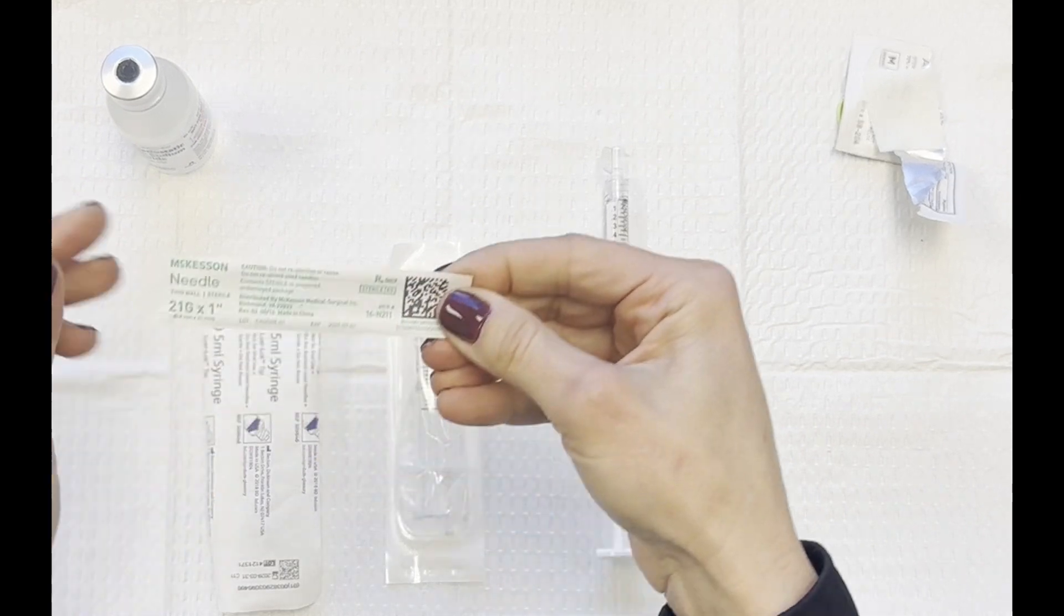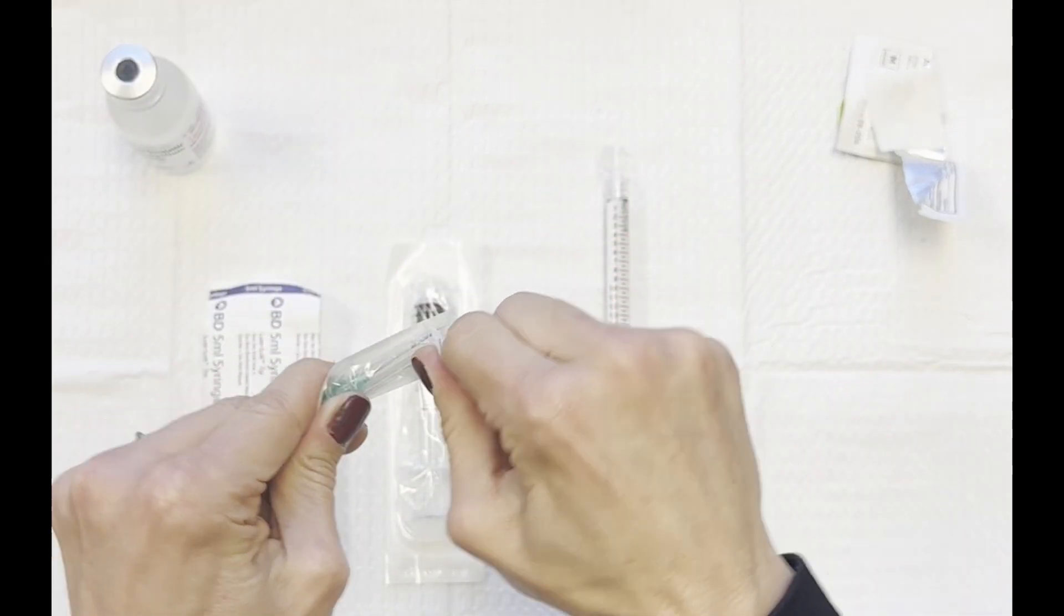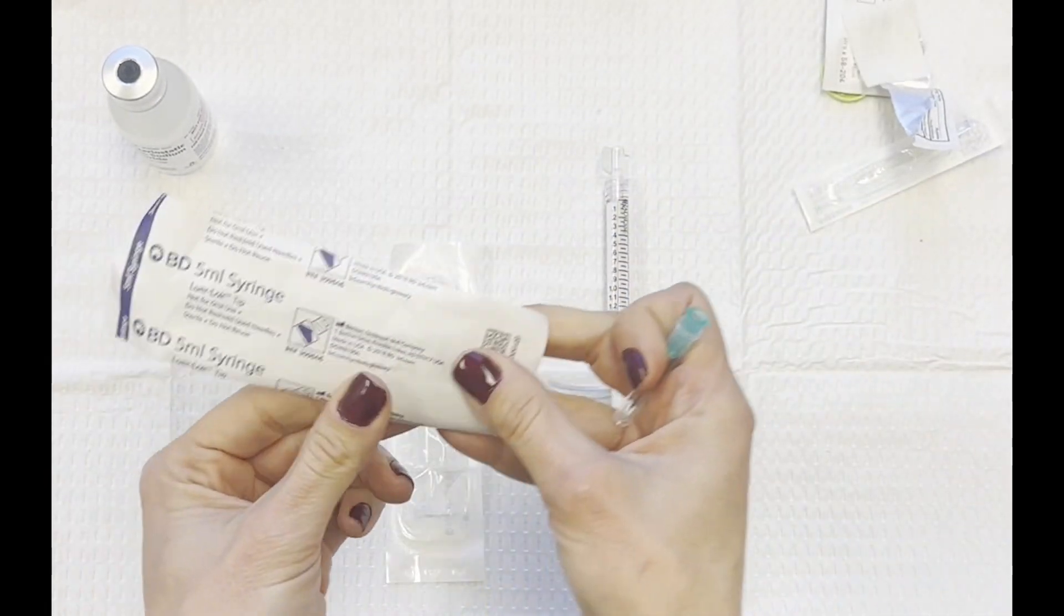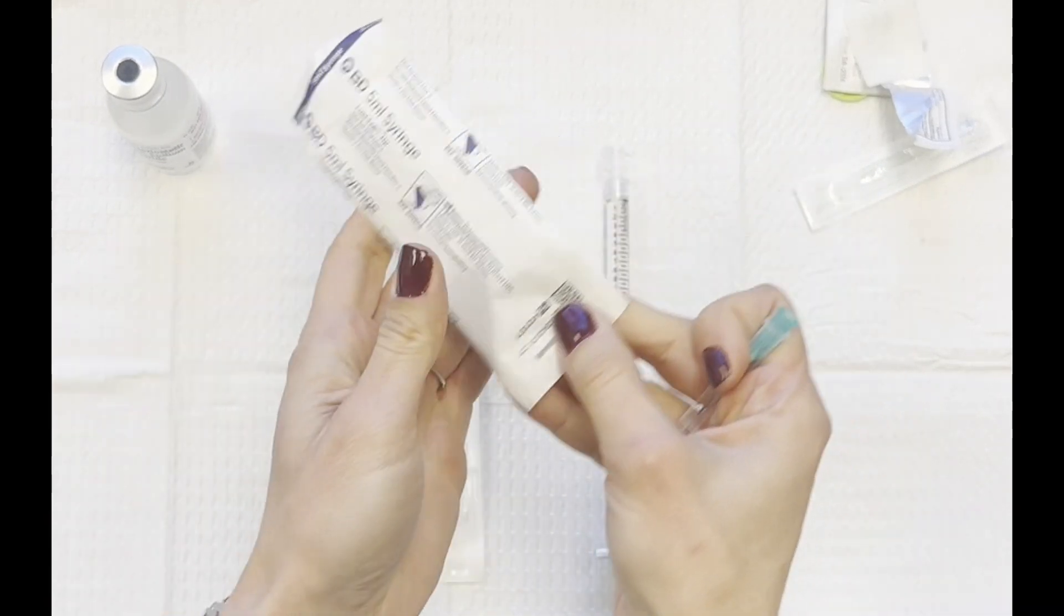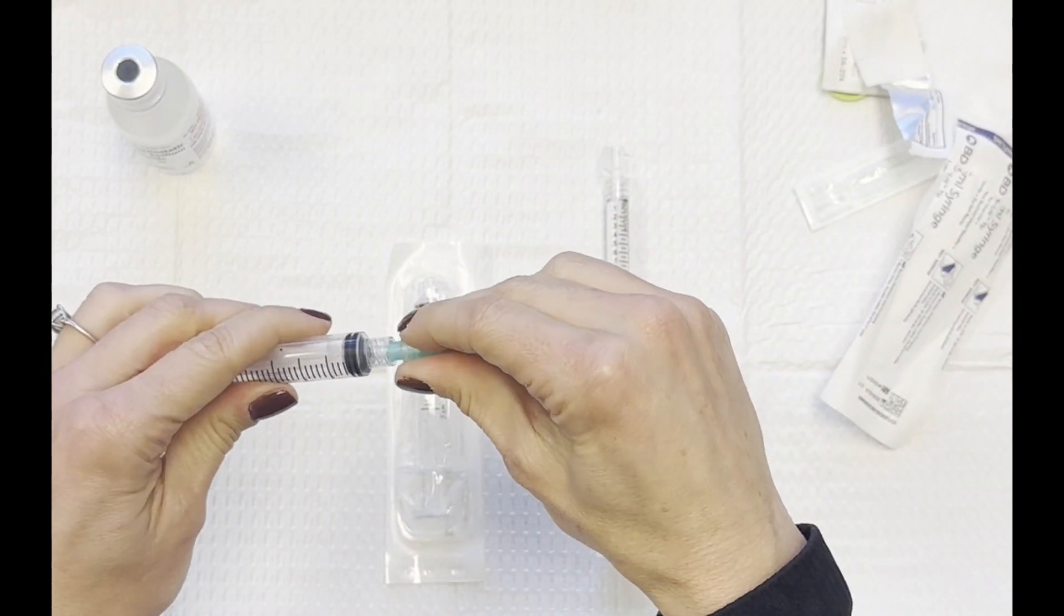So if I want to do a 1 to 2 ratio, meaning one part Radiesse, two parts normal saline to dilute it down, I'm going to draw up 1.5 times 2, which is 3cc's of bacteriostatic normal saline.